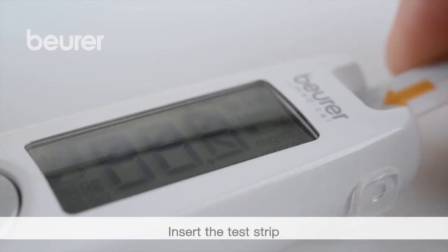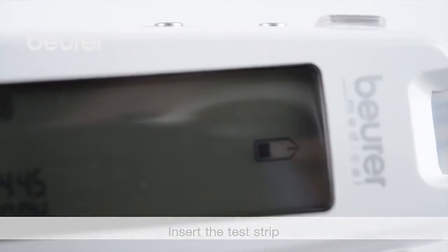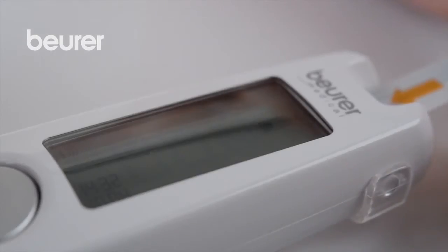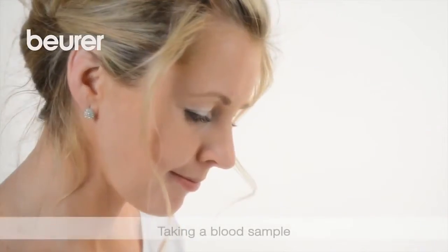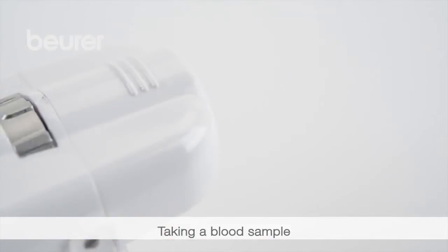Insert a test strip into the device with the contacts first. The device switches on and is ready for measurement as soon as the test strip symbol and the droplet symbol appear. Your hands must be clean and dry.